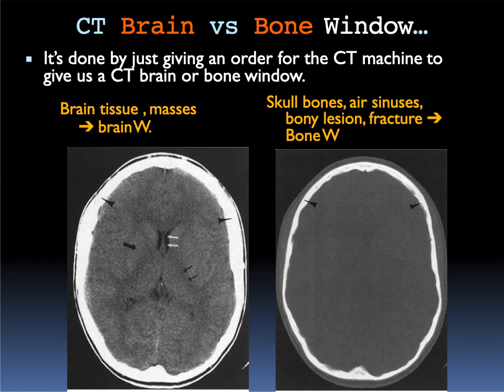So CT brain, when we do CT brain, we have the brain tissue window.